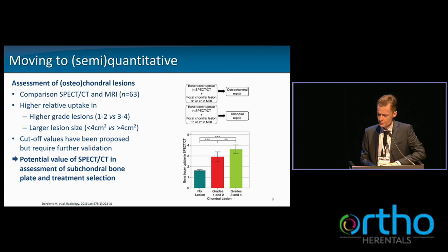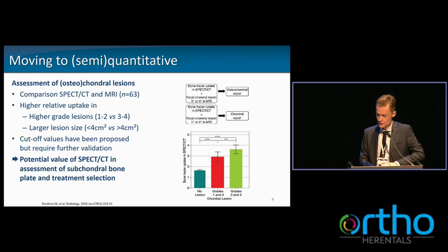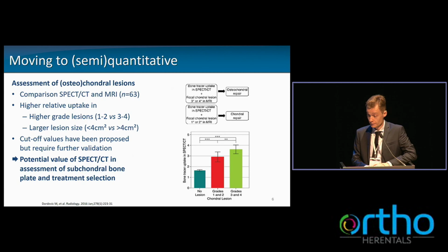So there is potential value in getting more out of your data set by doing these semi-quantitative measurements to select patients for an optimal treatment in this setting.